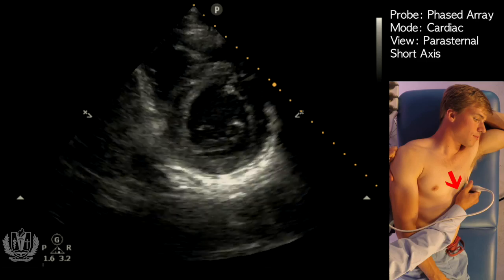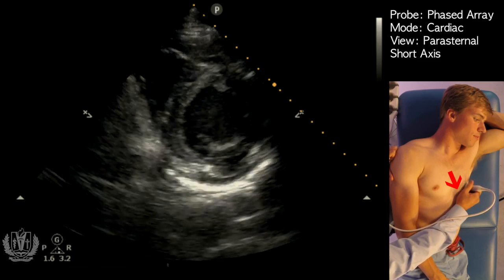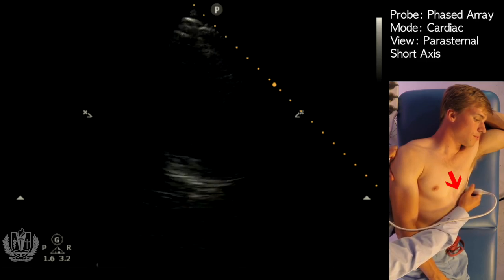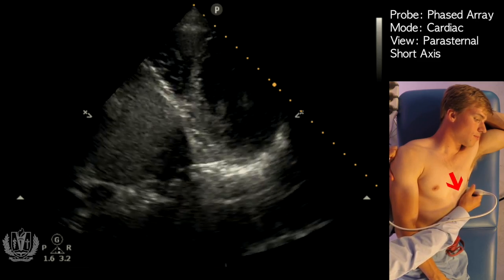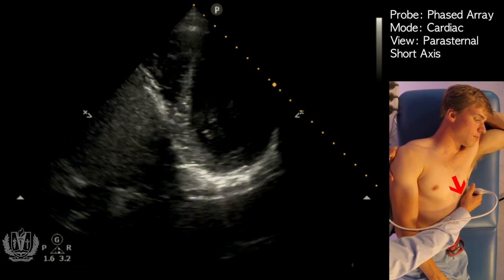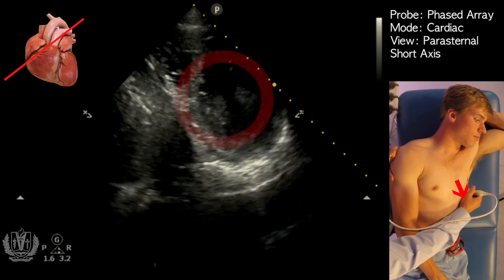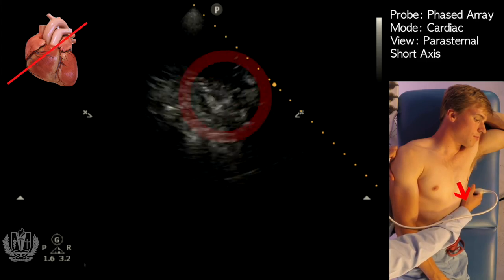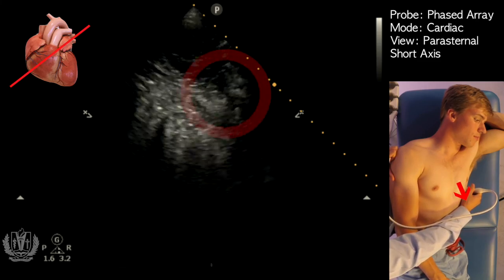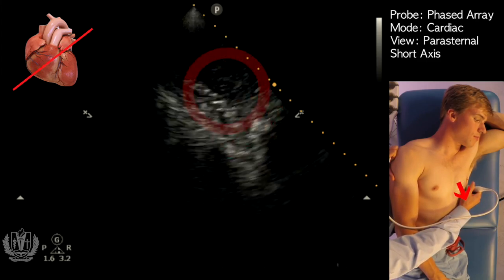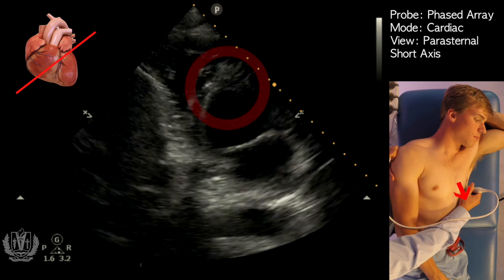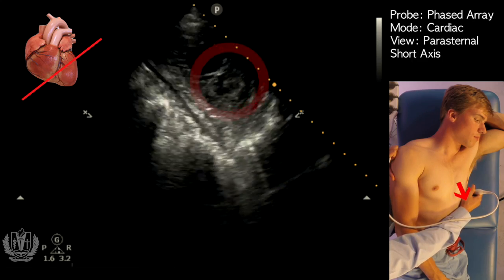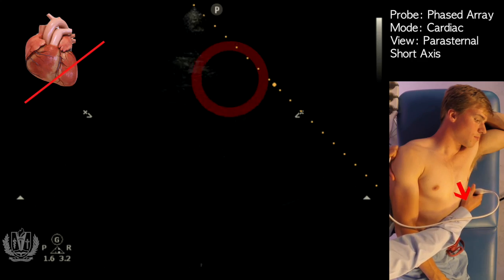Here is the short axis view, and as we're coming down, if you think of the heart as a cylinder, the cylinder gets smaller as you get towards the apex. You can see how the left ventricle is getting smaller and smaller as you reach the apex.